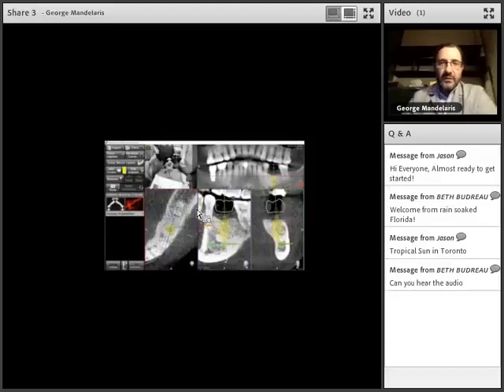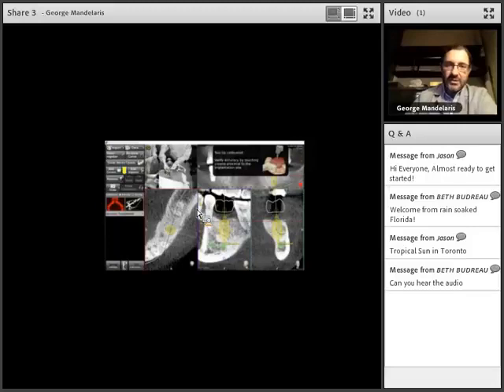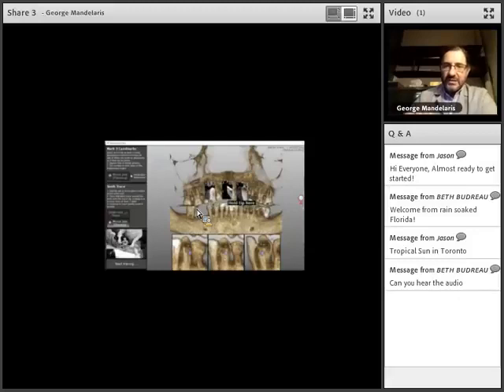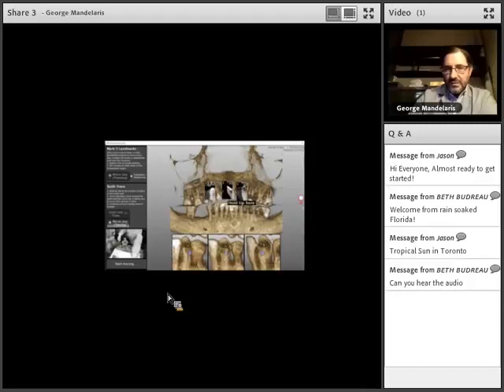I'm showing you her video, and basically what you can see Sylvia doing here is calibrating the tip. This is the tracer tool tip that she's calibrating. She's using the older calibrator, but nonetheless you get the point. So she's calibrating that, and then here are a couple of points that she has indicated that she wants to trace. Now once that's been registered, she's going to go ahead and use those 3 teeth to trace.